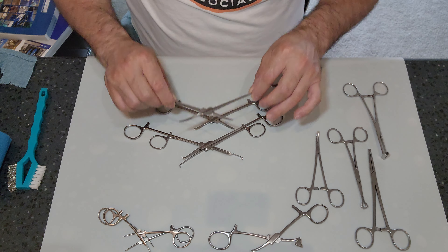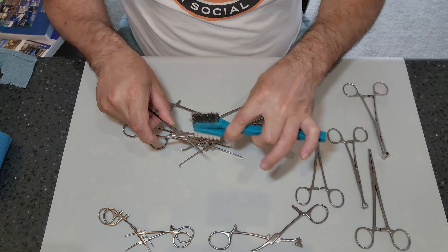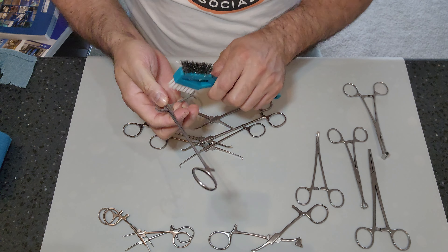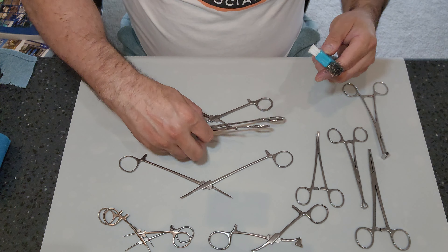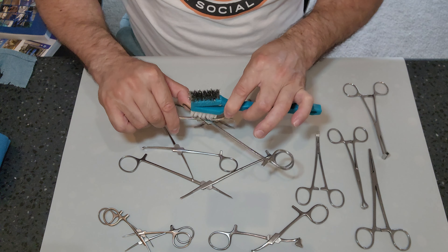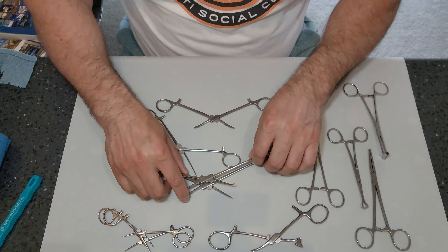After your contact time, use either a soft bristle brush or whatever is specified in the IFU to work off those soils — both visible and non-visible — working all aspects of the instrument, then place it into the final sink. We usually group instruments together, but it's important that we hit both sides of the instrument. Technically, when we clean instruments, we should be cleaning them one by one. Yes, it's time consuming, but if we want to do it right, this is the correct way to do it.